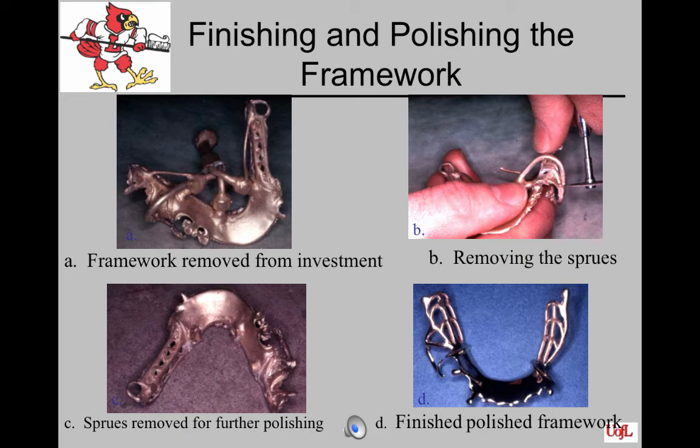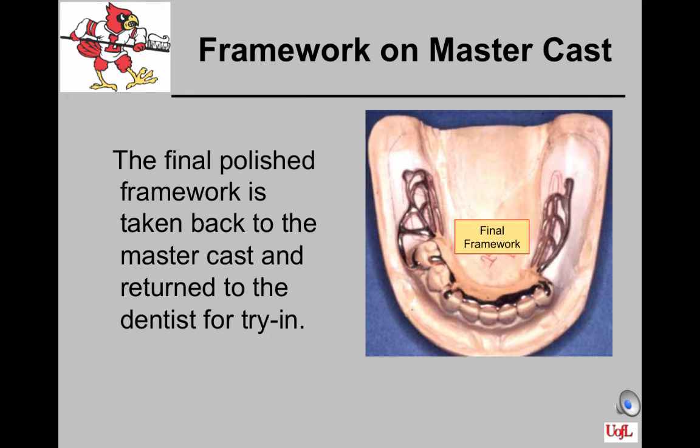All of the sprues must be removed, and the framework is then polished and taken back to the master cast for delivery to the dentist. The final polished framework is shown here on the master cast. It is returned to the dentist for try-in.